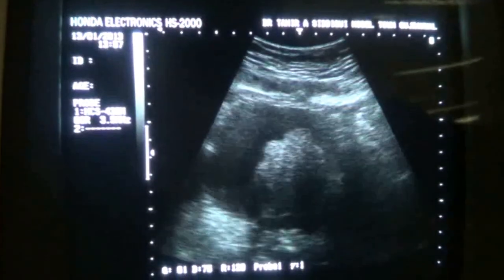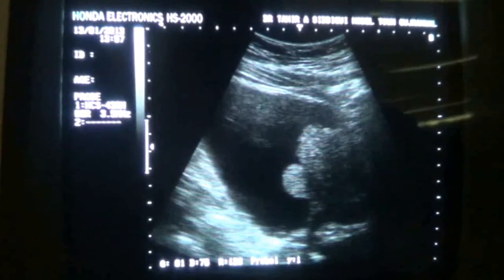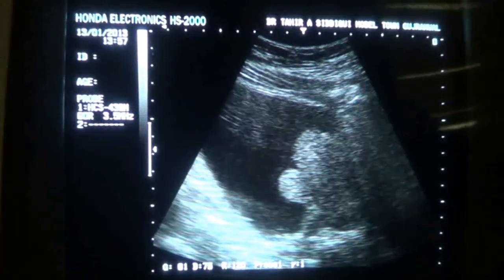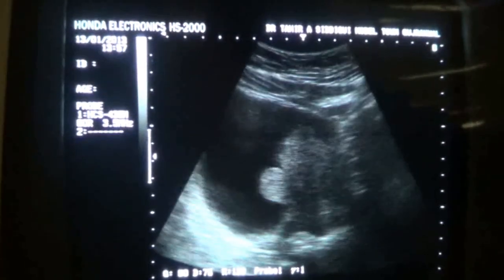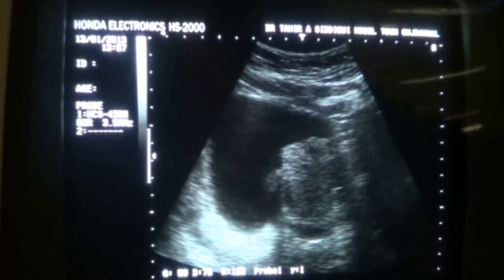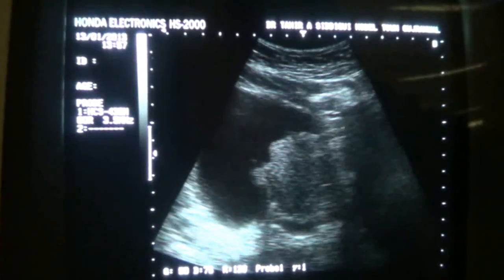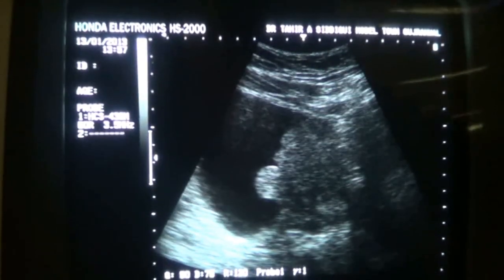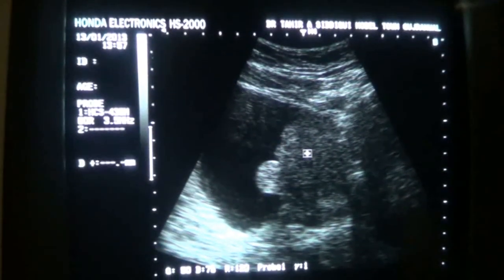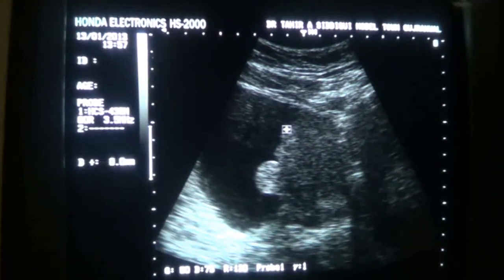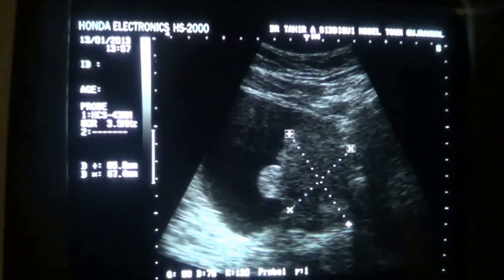This is the transverse section. Now let's see in the longitudinal section. You can see it becomes a part of the prostate in longitudinal section.